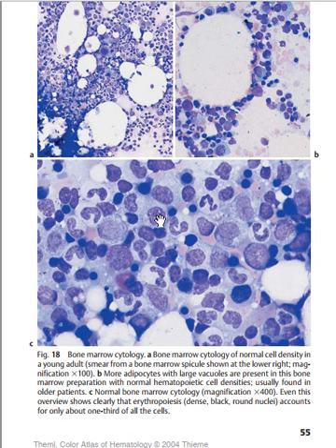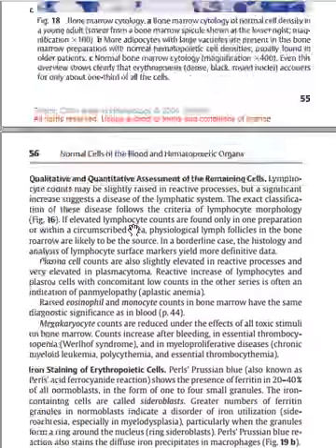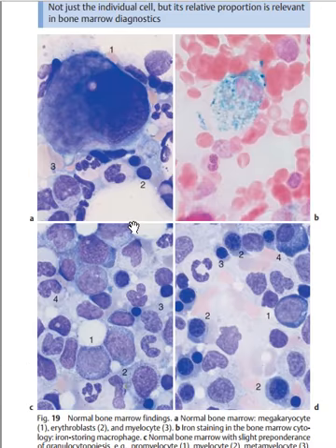Like this one here, which has a very clear nucleus, is going to be more of a precursor. The ones that have a clear nucleus, as you can see here, are more precursors, while the ones that have the darkish nucleus are the descendants. Is it clear? So the one that has a white nucleus is made up of euchromatin. So they are more of pro-myelocytes, pro-erythroblasts, and all that, while the ones with a darkish nucleus are at the end of the series of production. Is it clear?